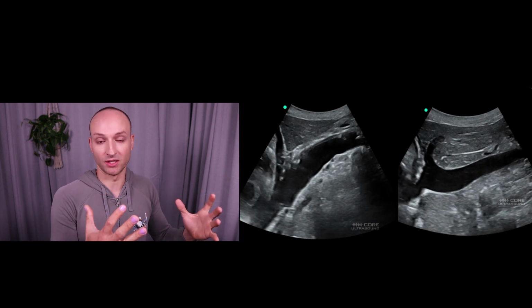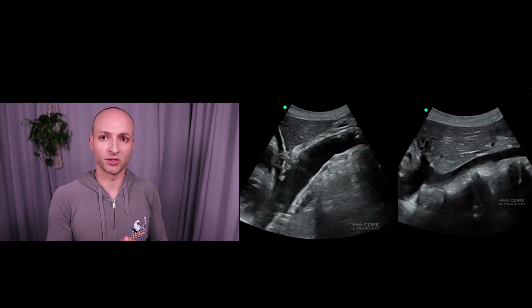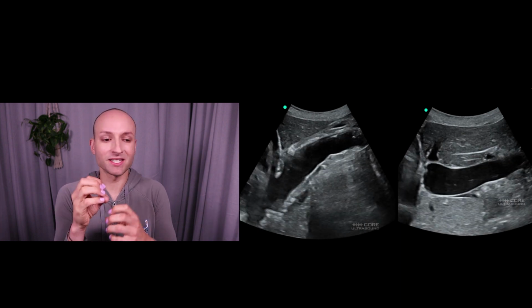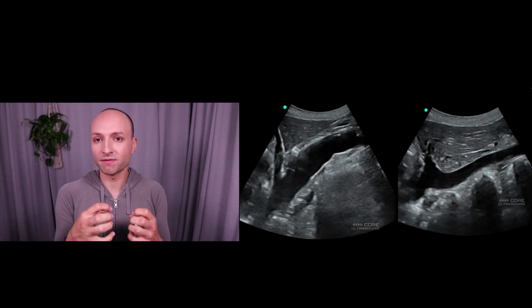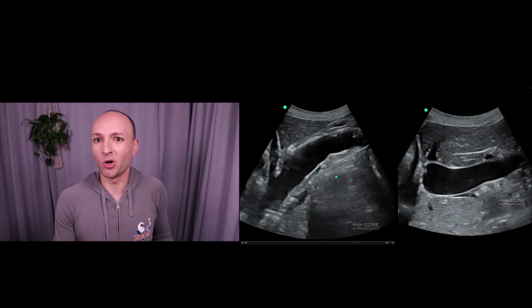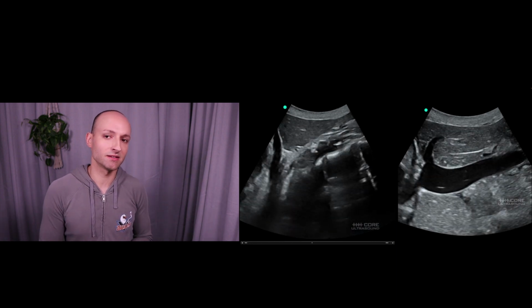In textbooks, traditionally, the IVC itself is thin-walled, non-pulsatile, and not muscular. But the IVC sits right next to the aorta, and I often see pulsatility with that IVC. Sometimes the walls, I don't know what a thick wall is for this patient, but maybe they have some vascular disease, and the walls are a little bit thicker.